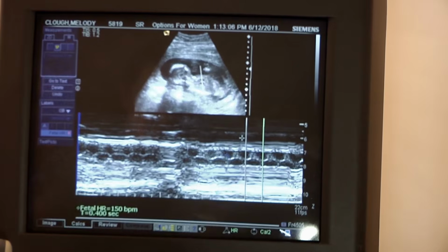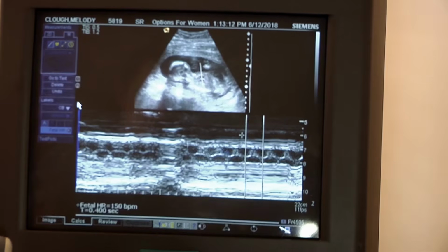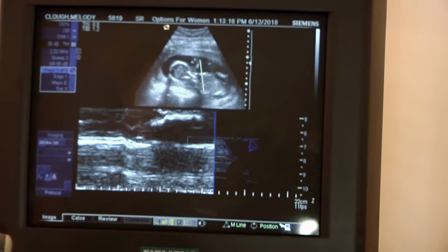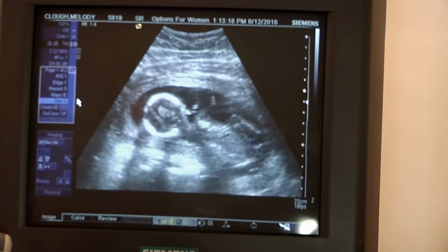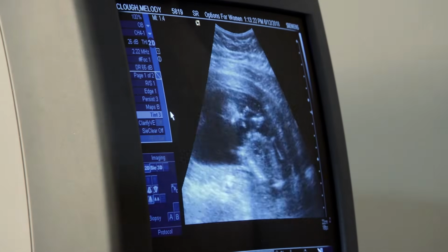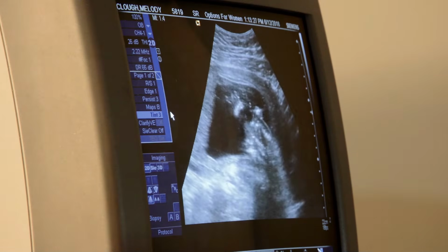There. 150 beats. Good. Okay, do we need to save that one? No, we got it already. Okay, so unfreeze. And now, how do I get out of here? Just hit M again or B again. Perfect. Okay, now let's go back transverse to baby's lie and go down. Now here's the head. Okay. Travel down the road and get the femur.